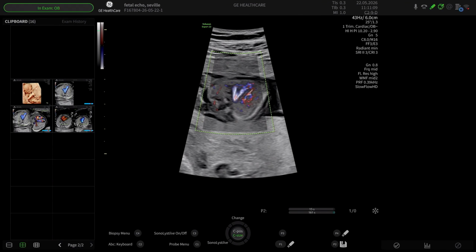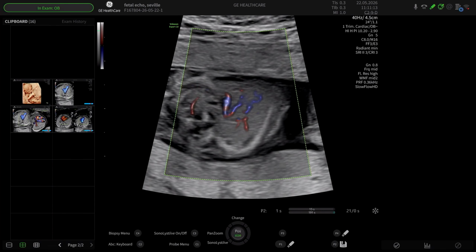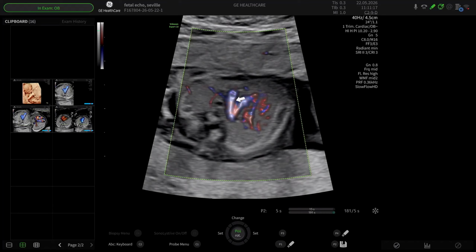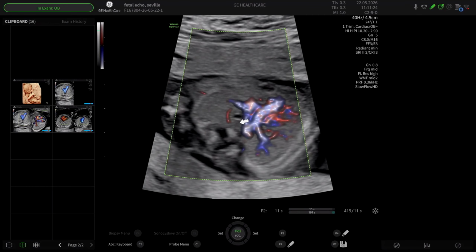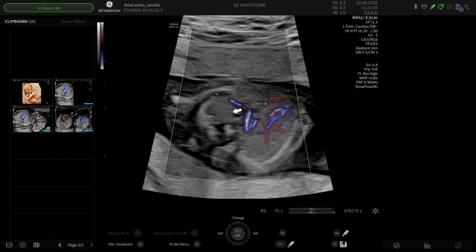And in this position, by the way, as I come across this, if I can just ask you to have a look, you're not just seeing the pulmonary arteries, you're seeing the tiny little branches of the pulmonary arteries as they disappear out into the lung parenchyma. And you can also see coming up in here, the superior vena cava.